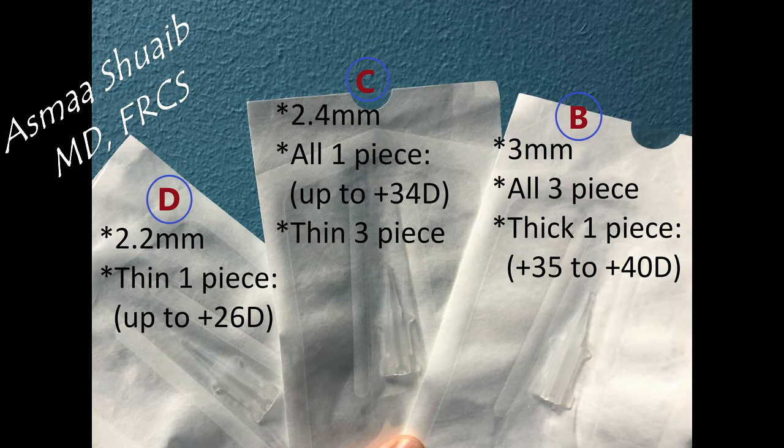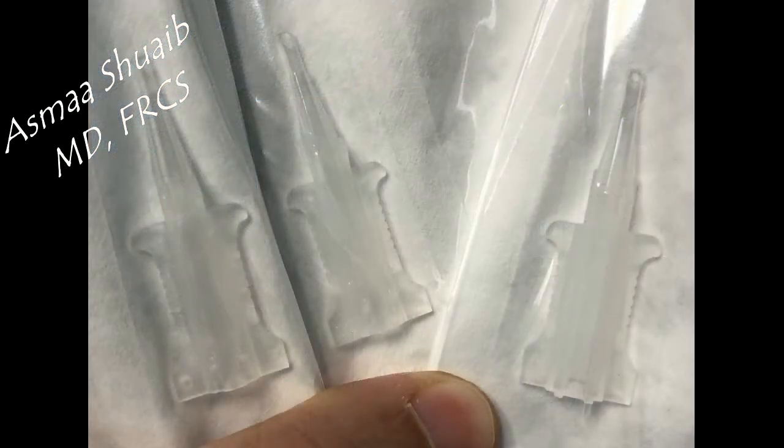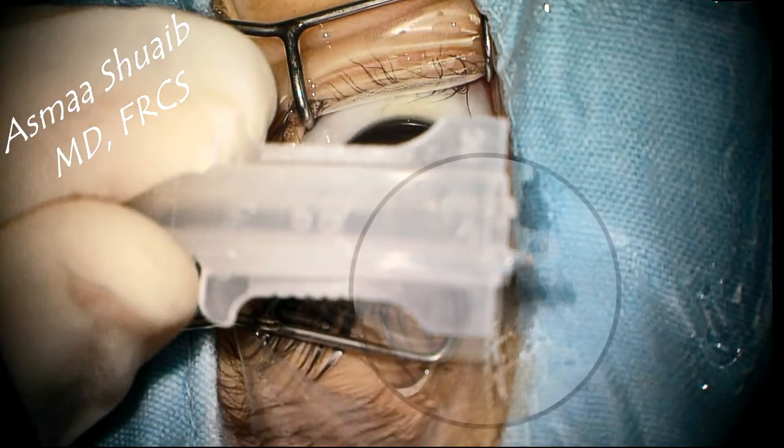This type of cartridge can be used for implanting any three-piece IOL, not only the Alcon. The B cartridge has a three millimeter diameter. The C and D cartridges are of smaller size and are mainly designed to implant one-piece foldable IOLs. But how to differentiate the B cartridge from the others?